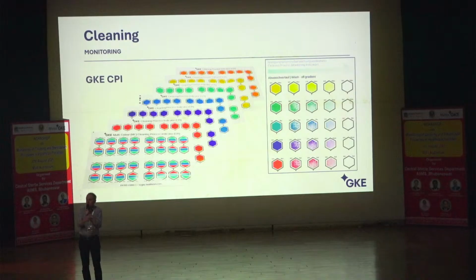To find one which provides monitoring information for you, and not some abstract one which is only providing information, well, that you can show, look, I use an indicator. No, the indicator is made to give you an additional value, and therefore we have to have one which is very good to be used for your purpose.